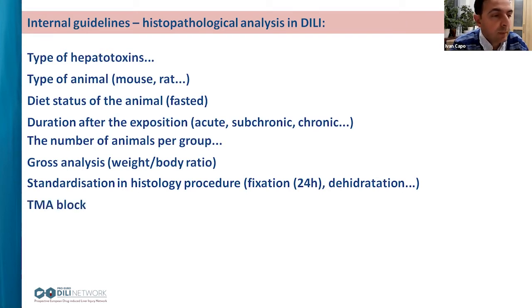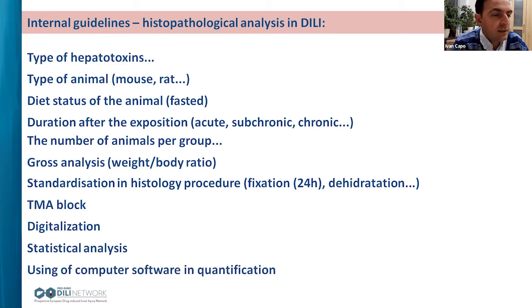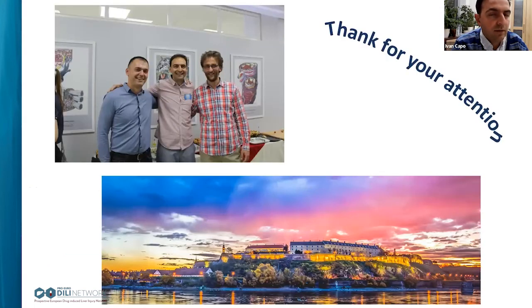Using a tissue microarray block is very useful, and we can also rationalize the use of immunohistochemistry, and we can standardize the analysis. After that, we can make a digitalization and statistical analysis, and finally use computer software for the quantification. So this is for my colleagues from pharmacology.